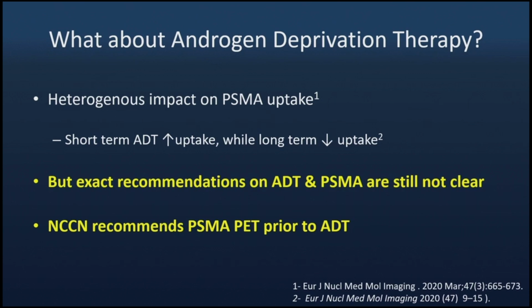But he didn't do it as a bridge to treatment. He did it as the ADT, and then he imaged the patients. He didn't do it as a bridge to therapy. I thought that's what the question was. No, he was asking if using it prior to initiation of therapy for detection, correct? Yeah, and increase your detection rates. Tom did it in a patient, and he imaged a bunch of patients.